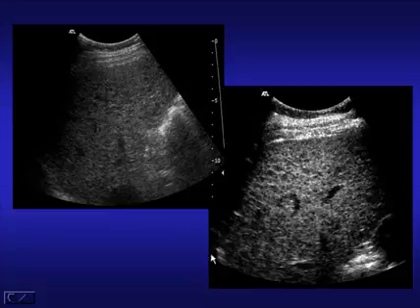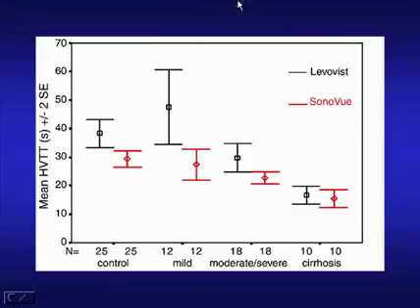After administration of contrast and viewing in the delayed phase, we can see that this nodular pattern has been enhanced, and we can see much more clearly the individual nodules, their size and size variation that go up to make the standard cirrhotic pattern. So we can use this in diffuse liver disease not only for detecting malignant focal lesions, but also for enhancing the pattern of nodule formation.